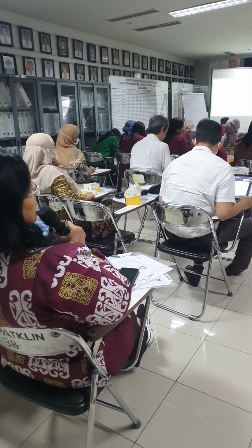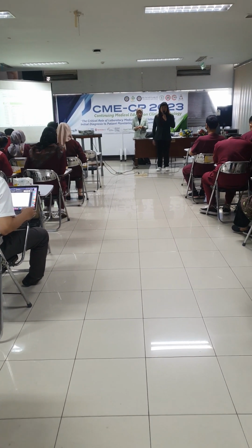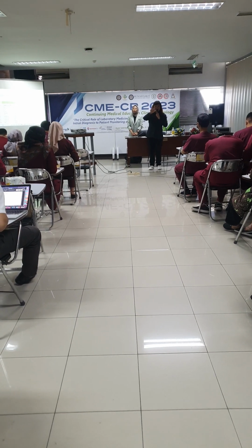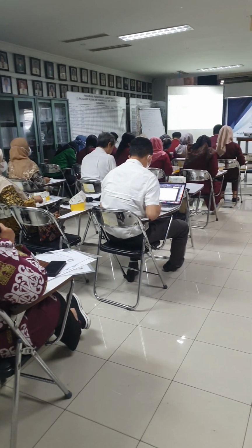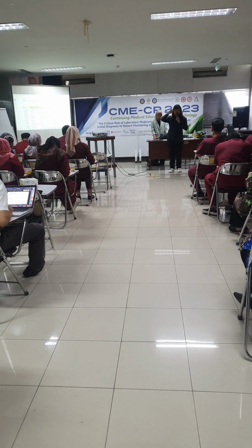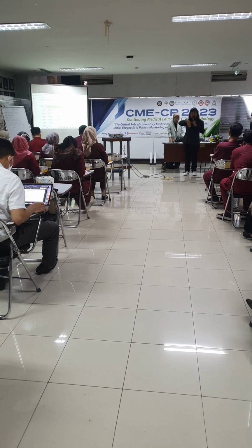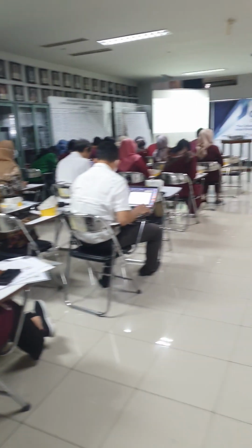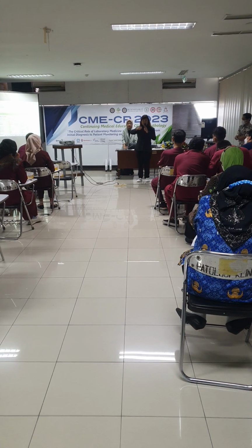How about for CMV? Okay, with your experience on MDX itself, basically you have more than 50% of the knowledge already. That is 8 wells. Just for 8 samples, you mean? 8 samples. If you remember the video, we have a flap. That flap will be able to tell whoever is, let's say the lab has more than 2 people, different shifts. So when we have the flap down, it sticks on permanently, you cannot reuse.